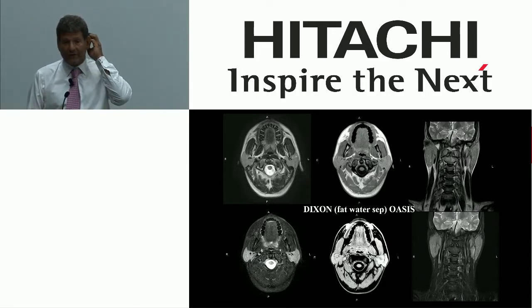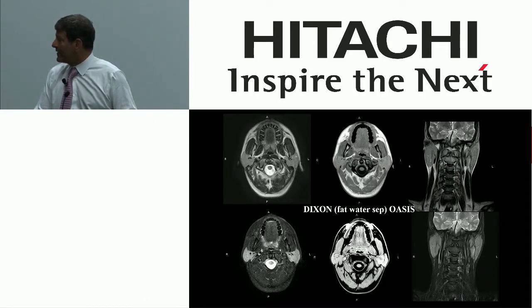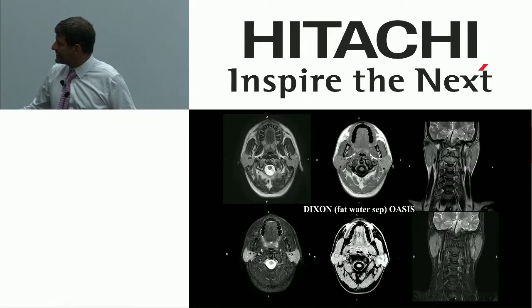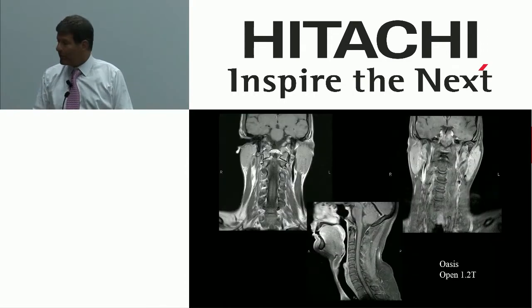Brachial plexus, soft tissue neck, some of the spine exams that we do, some of the extremity exams we do, beautifully done with fat suppression. And again, what you're seeing here is a 2-for-1. This is one acquisition, this is another acquisition, this is another acquisition. With and without fat suppression, so you can get the best of both.